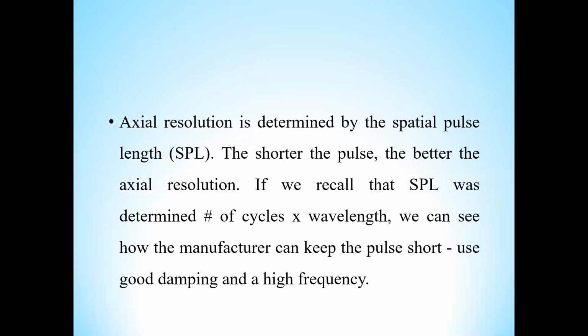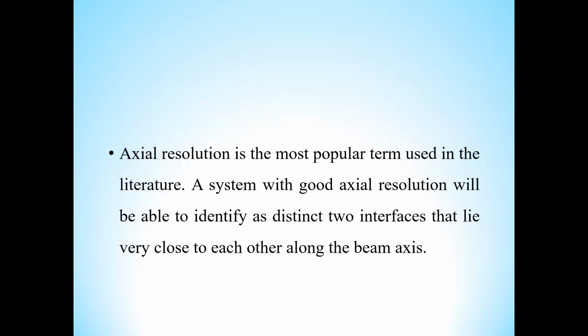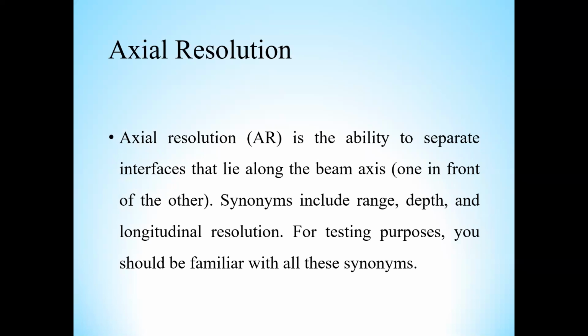So how can we increase or decrease the length of a pulse? By damping materials. Use of damping materials.